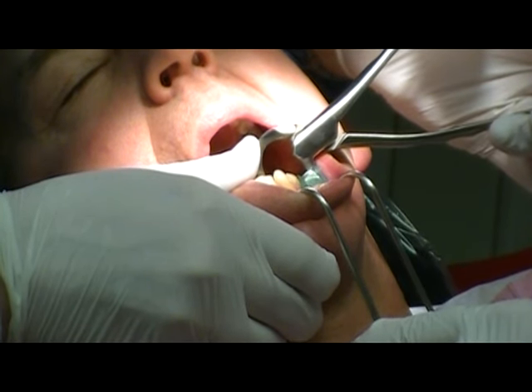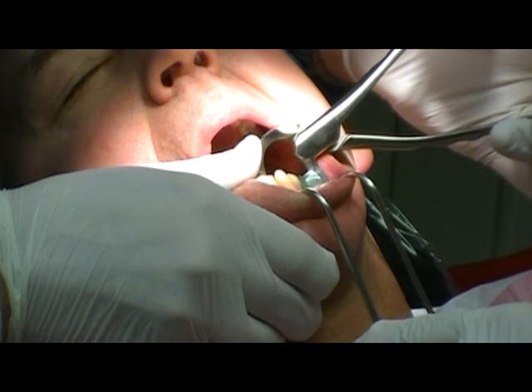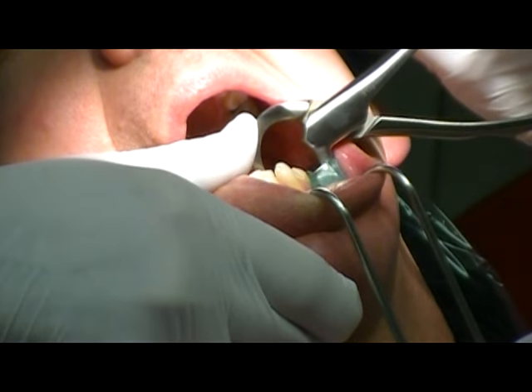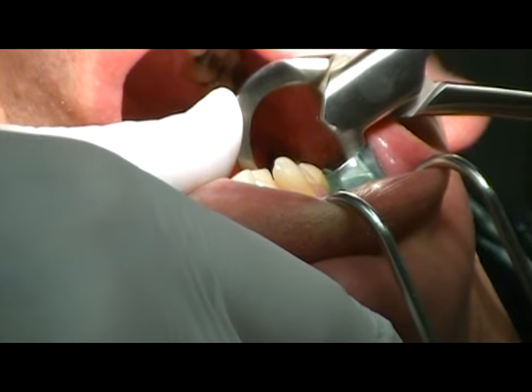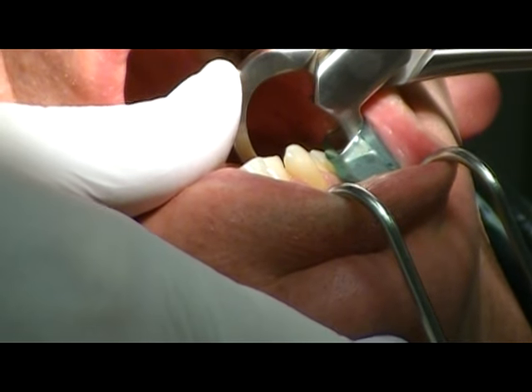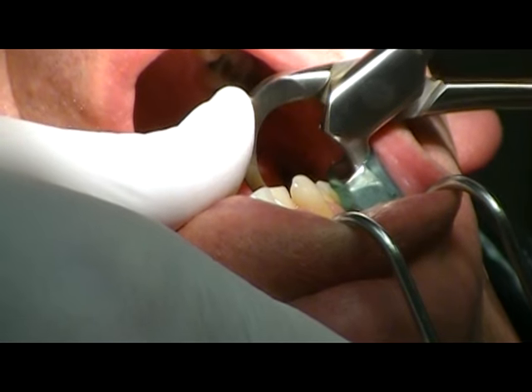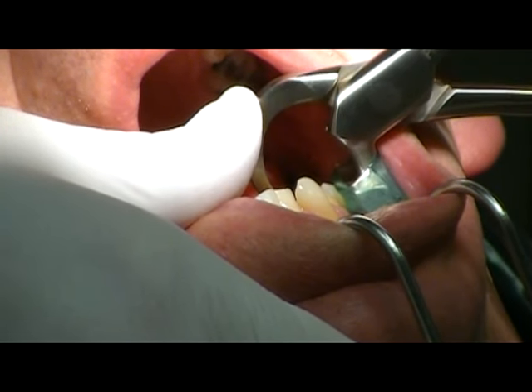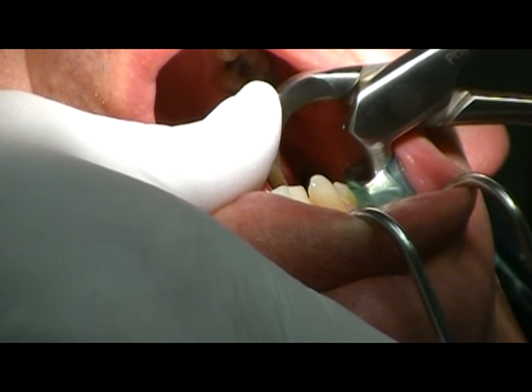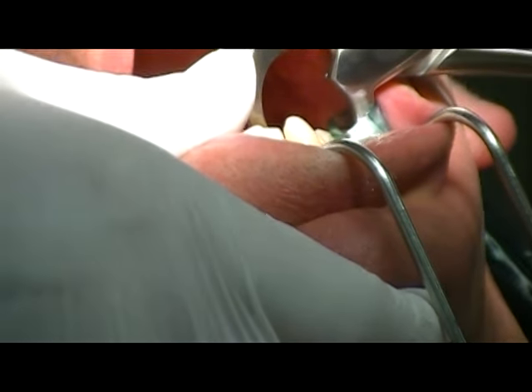I am really holding the forcep with two fingers and a thumb and I am just rotating my wrist downwards. There is no arm strength at all. Just rotating very slowly — it can take a minute or two. I am using my thumb just to hold the beak on the lingual so it doesn't slide off. You just have to take your time.